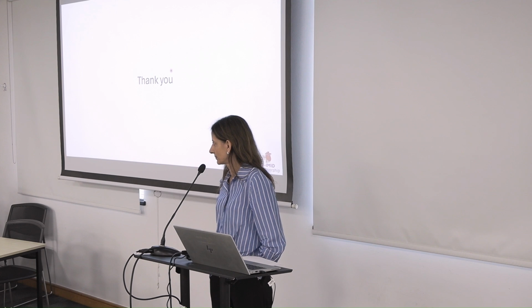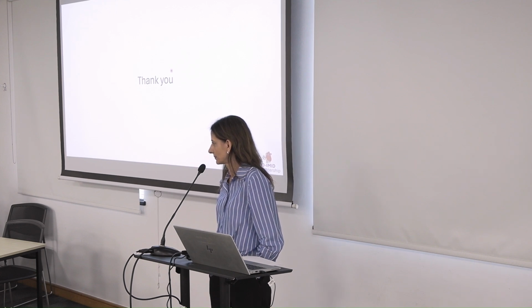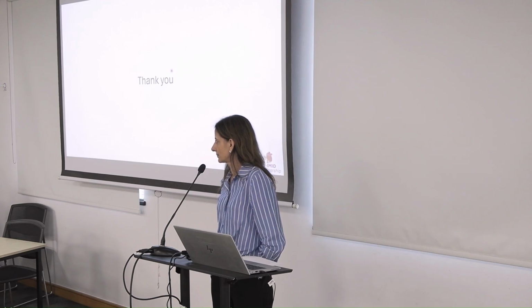And they're a little bit specific to your scanner, so you begin to understand what's an artifact on your Philips versus your Siemens. So I'm waffling a bit because there's not a single answer. There's not a straightforward, this is how you do it. But it's a combination, as always, of trying to have the best possible image quality you can get with the best possible training of those reporting.